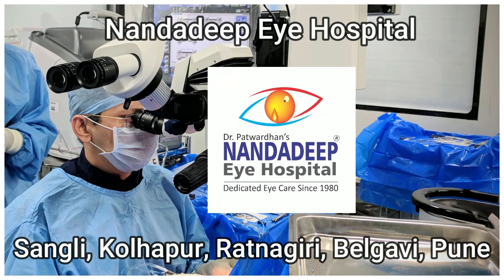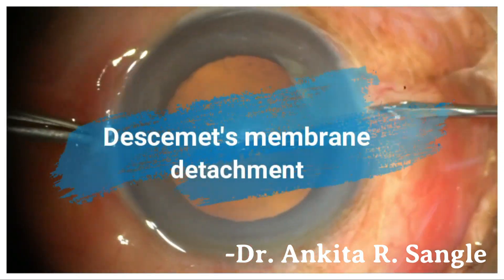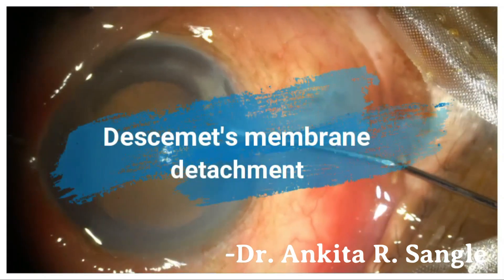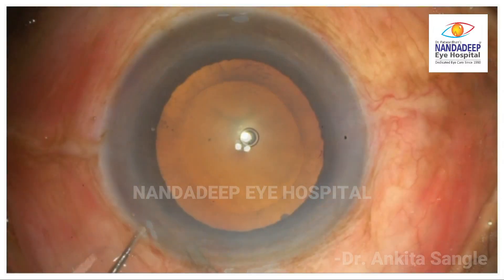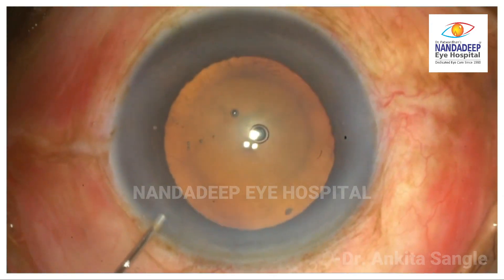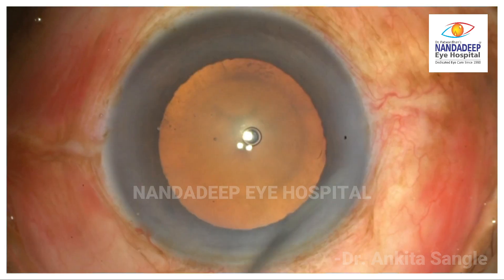Hello everyone, let's watch Desmet Membrane Detachment during cataract surgery. Here we have a surgeon operating who made a side port incision, and while hydrating it — well, there you go — Desmet Membrane Detachment involving the visual axis.